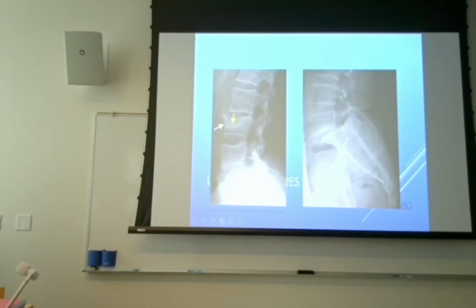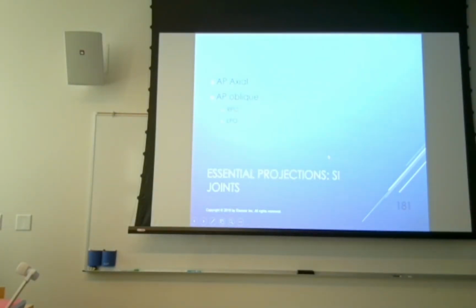Whether or not this was this patient's particular problem, I don't know. You see on this vertebra right here, you see the way that looks a little bit tubular. Okay, that's what I was talking about before in the non-coplanar, right? You're looking at kind of the bottom side of that vertebra. What you want to see is it nice and blocky looking like that and not having that hollowed out looking appearance. Okay. Any questions?